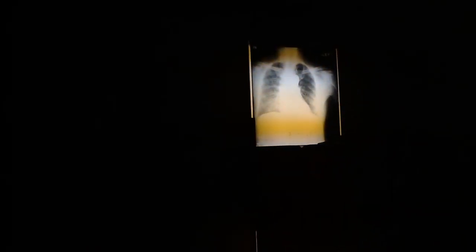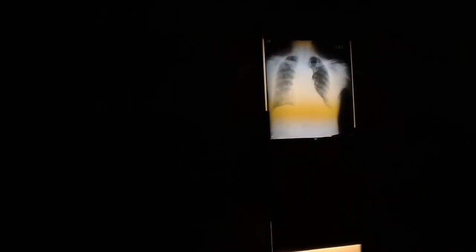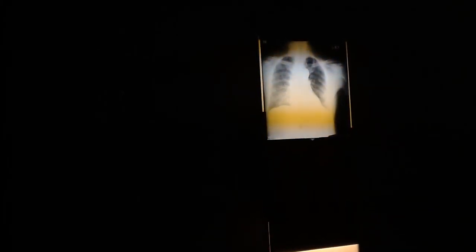These are miliary. The problem with 1 to 2 millimeter nodules is that's a non-specific chest x-ray. So what would we like to know about this patient? Occupational history, symptoms, how long they've had it, duration. All of those things are important. Have they been running a fever? Is it a high fever or a low-grade fever? Do they have difficulty breathing? We need to know all of those things.